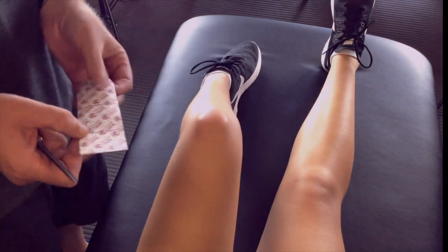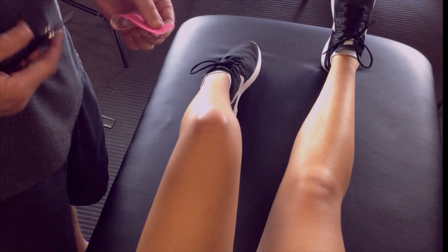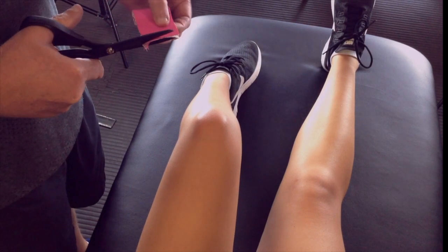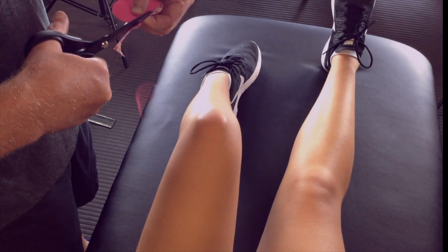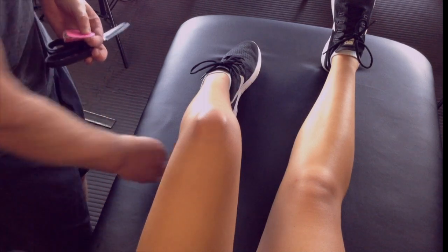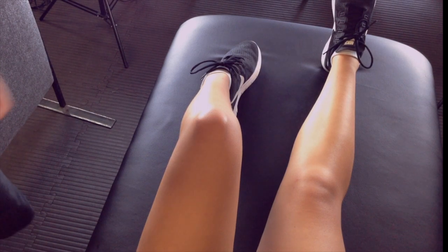Now the second taping job we're going to do is using the elastic kinesio tape. For the average size knee, you'll need about 20 centimeters of kinesio tape. Notice that we round the corners of the kinesio tape — this is just to make the taping last longer. We find that if you've got a sharp corner on the kinesio tape, it'll start to peel off almost immediately.